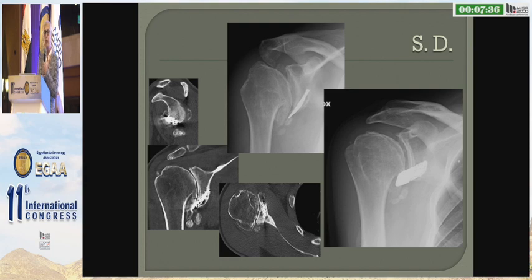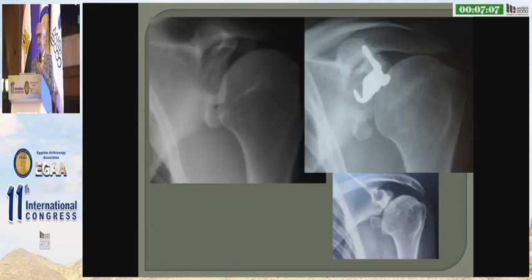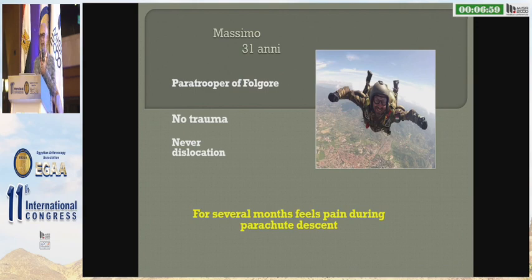And sometimes the patient will not redislocate anymore. But this is a devil device that a shoulder surgeon used for this patient. But what to do? You will be in trouble when you have to do arthroplasty. And this is a very, very young boy. The cartilages are open, and this is what the surgeon does. So no more dislocations, but early arthritis.